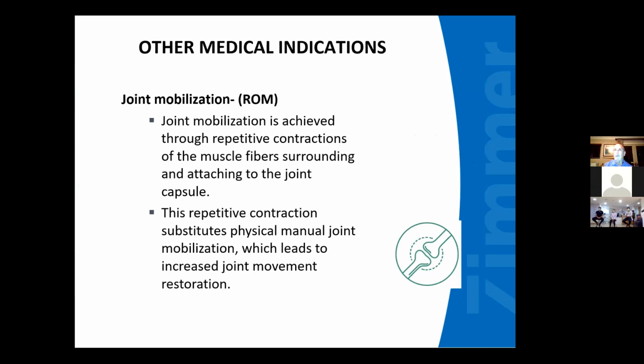to stretch adhesions to those muscle fibers surrounding and attaching to the capsule. The repetitive contraction substitutes for that physical manual labor. It's doing the heavy lifting for the clinician. It is doing it together.